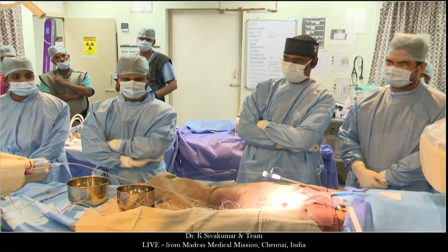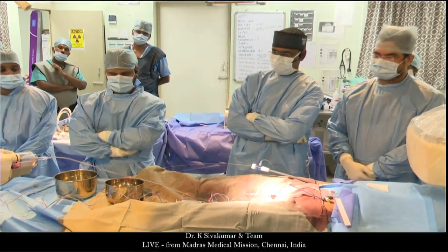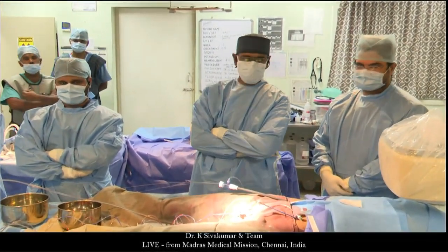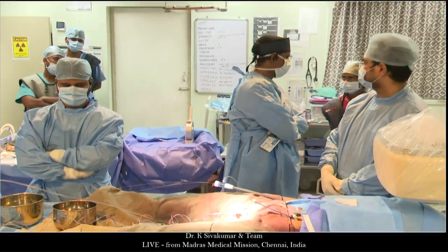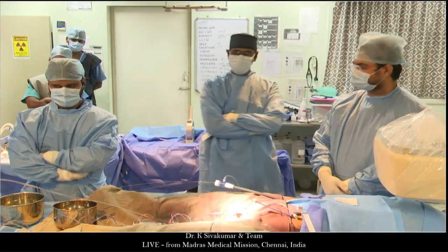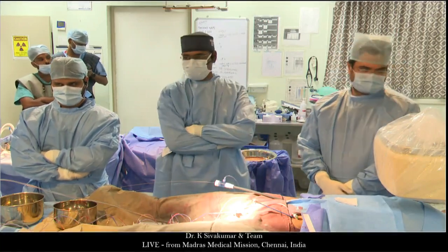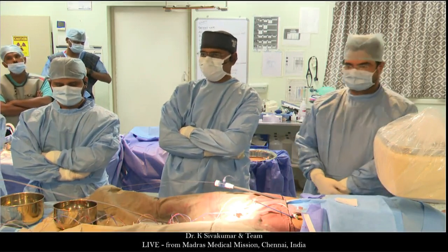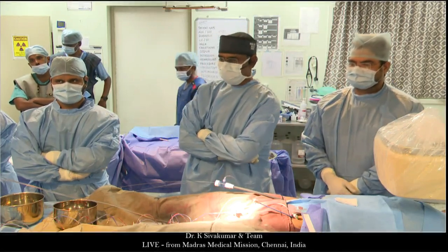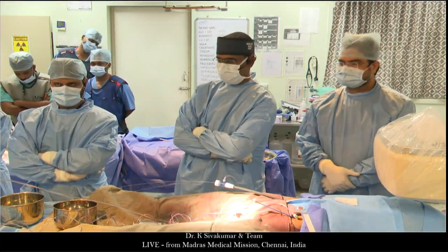I think at this age, maybe we can do the transcatheter approach because it's an older age, but I am not sure in the adolescents, in small kids, such as below 16, 17 years old. So you're worried about the age of the patient? Yes, the age is good because in smaller age, I am a little bit concerned. Okay, thank you. Huwaida? We would consider it in an older patient, but we have not been doing it in younger patients.